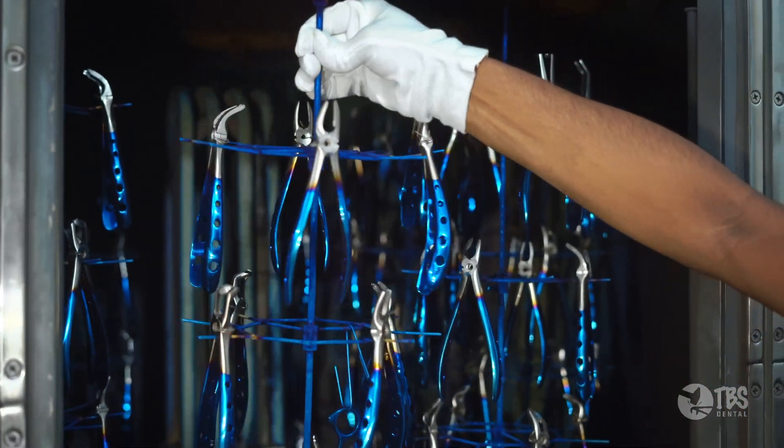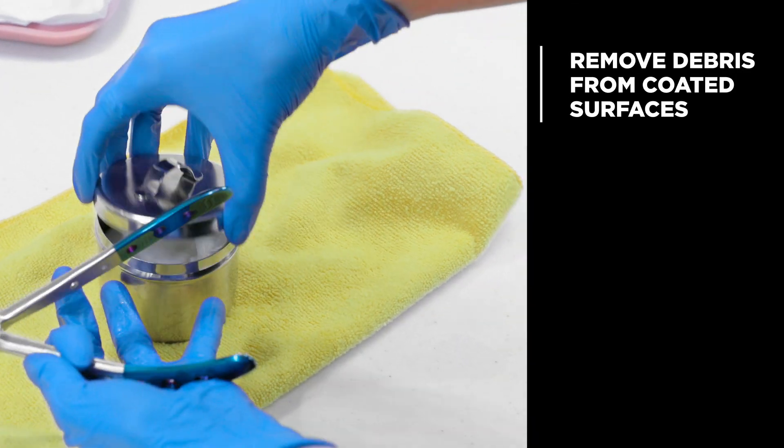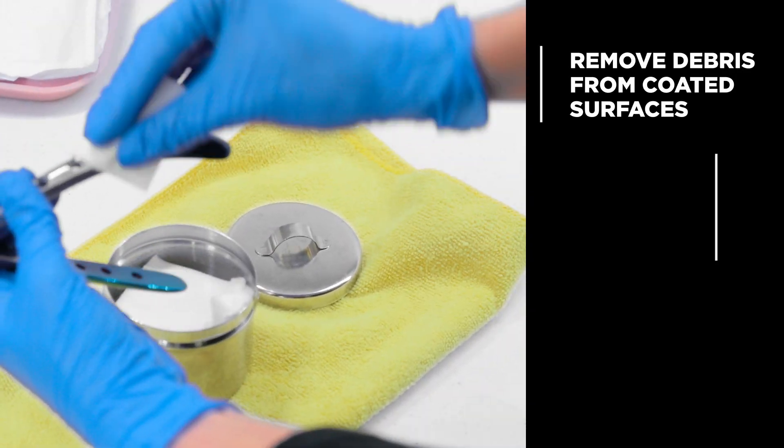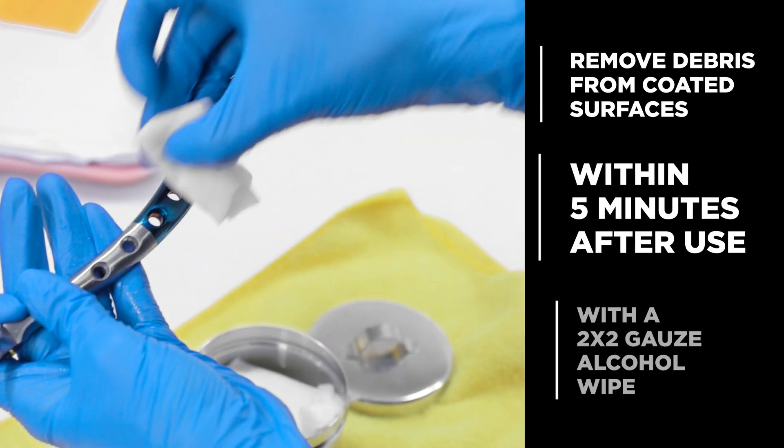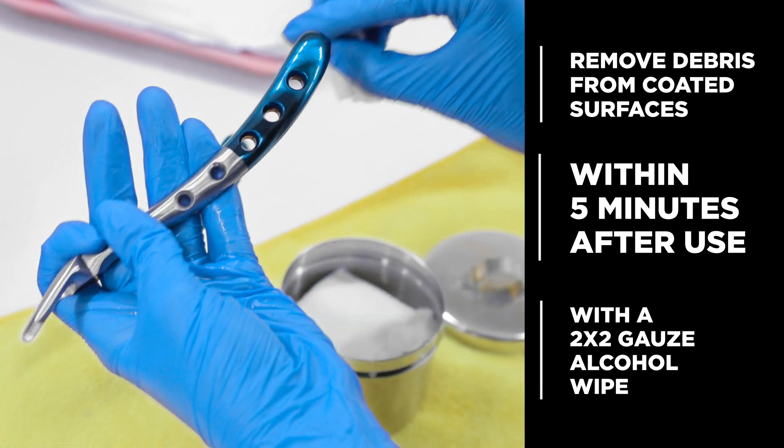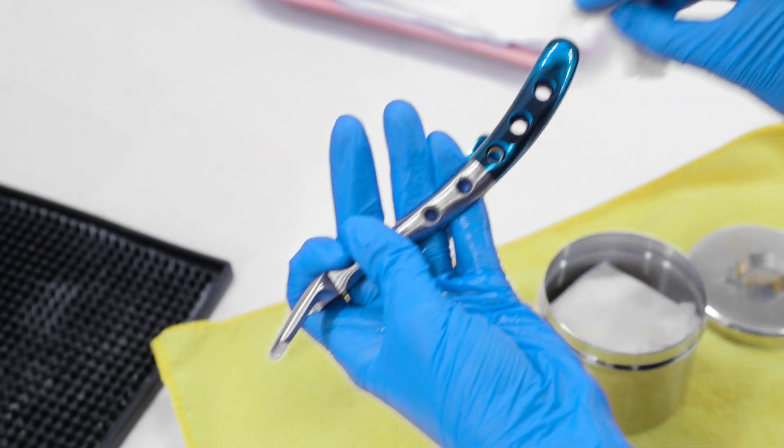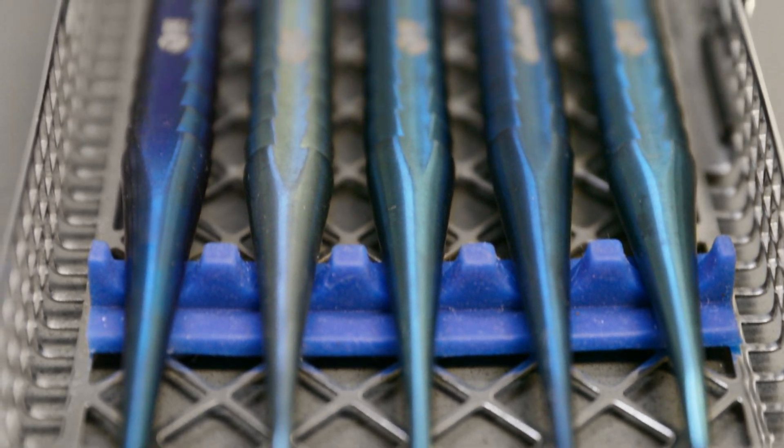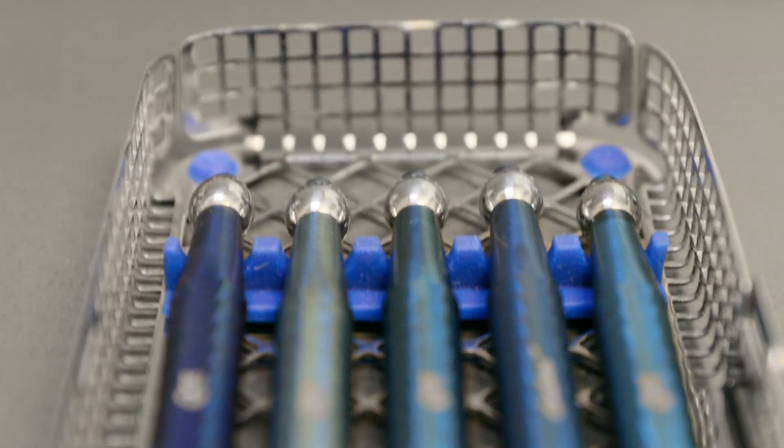Proper care should be taken to remove any residual composite materials from the blade within 5 minutes after use by wiping the coated area with alcohol on a 2x2 gauze. Composite materials or residue can harden on the coated area and affect the quality of future restorations.